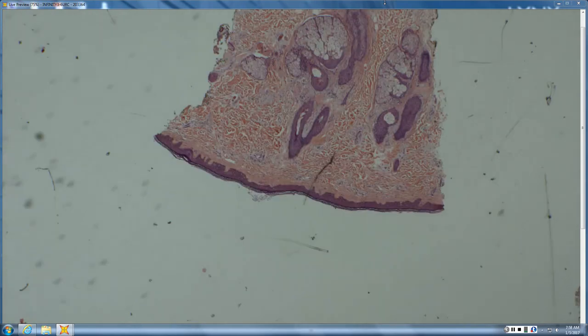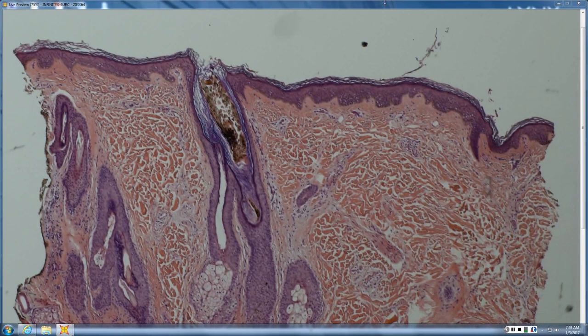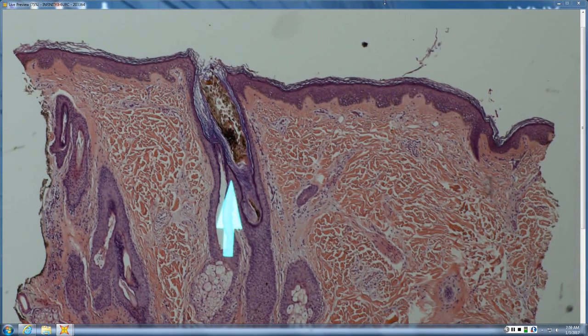First biopsy, so it looks like a pigment cast. So pigment cast, and what do you see pigment casts in? Trichotillomania, AA, syphilis, and it's just as common in trichotillomania and AA, so it doesn't favor one or the other. Unlike the pigment we saw before, this is not down in the fibrous tract, this is in the follicular channel.